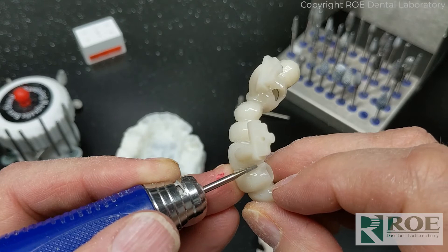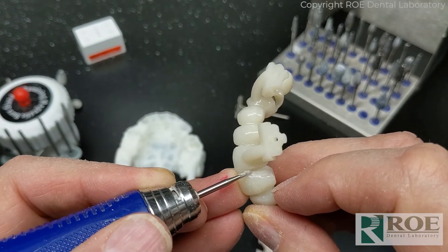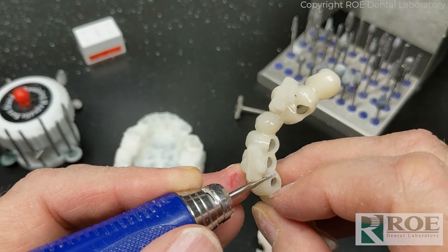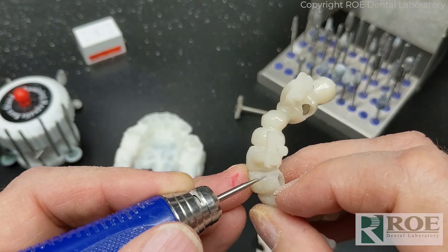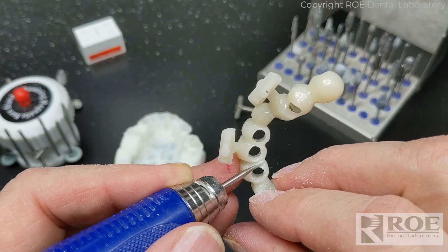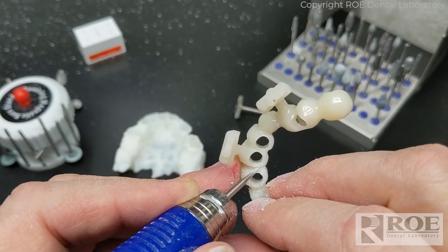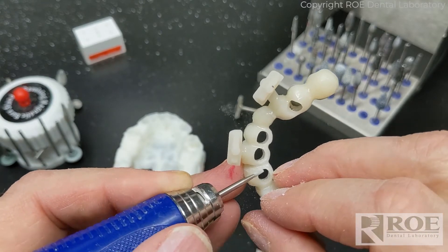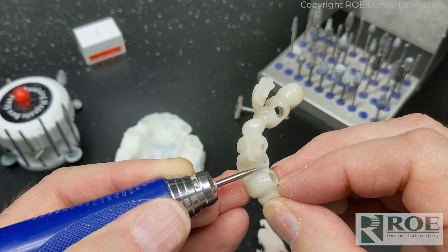The embrasure areas can be opened up to allow the intercrestal bone to stay intact as much as possible to help hold papillae. We want to try to keep papillae if we can, but we also have to consider strength. There will be times when you can only thin this out so much and then have to reduce some bone to allow the prosthetic to fit down.